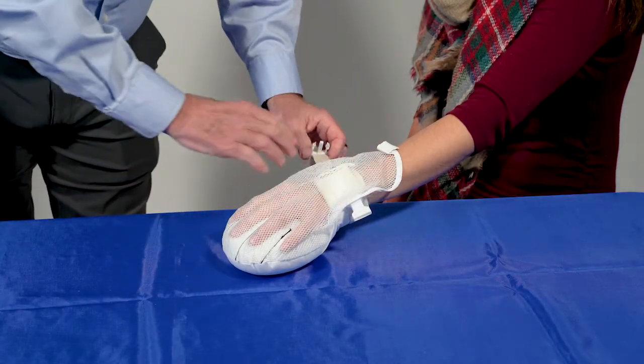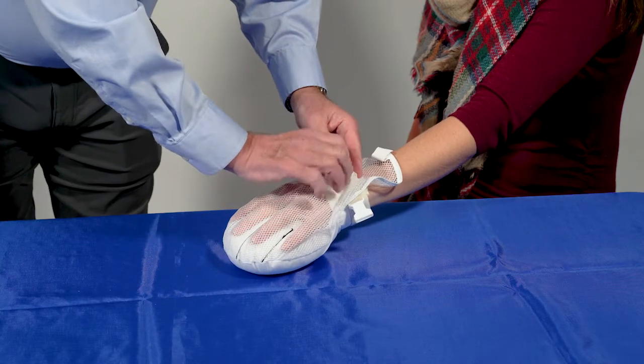Close the padded cuff around the smallest part of the patient's wrist and then secure with the hook and loop fastener.